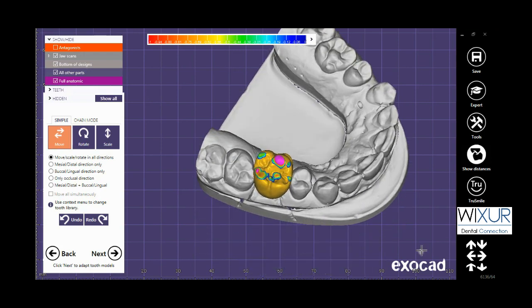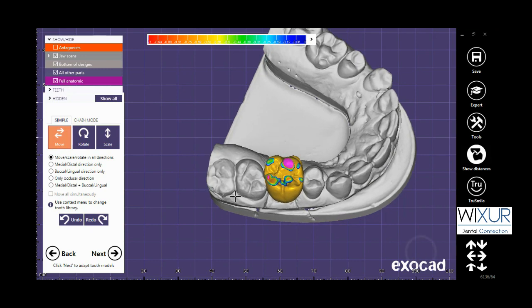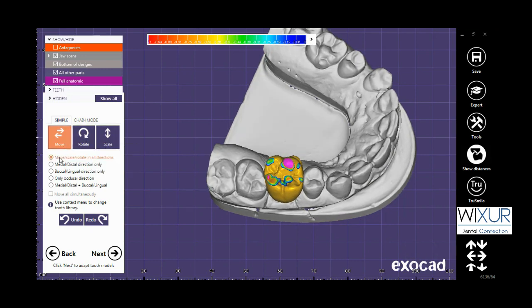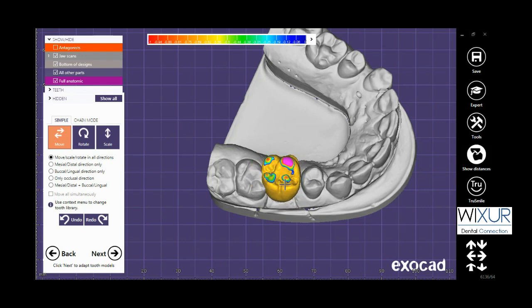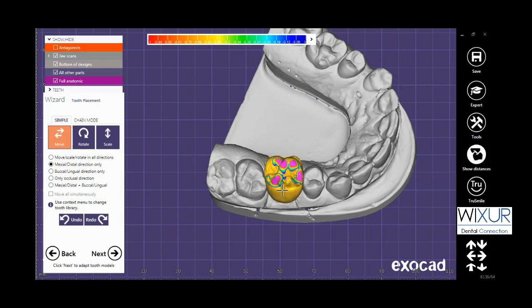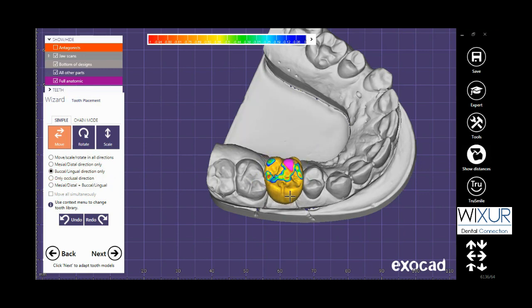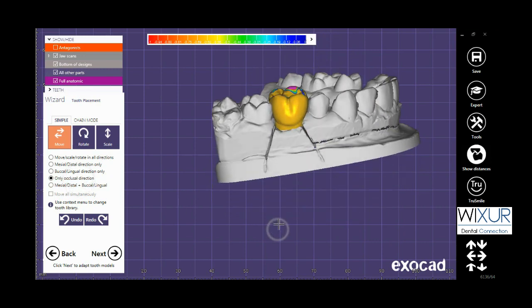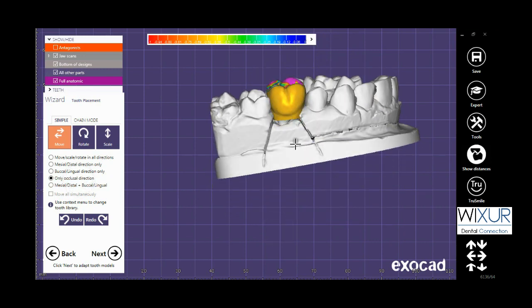I skipped previous steps and start from placement of the crown. Look at the window on the left — I can move the crown in all directions, or in mesial and distal direction only, buccal and lingual direction only, or only occlusal direction.